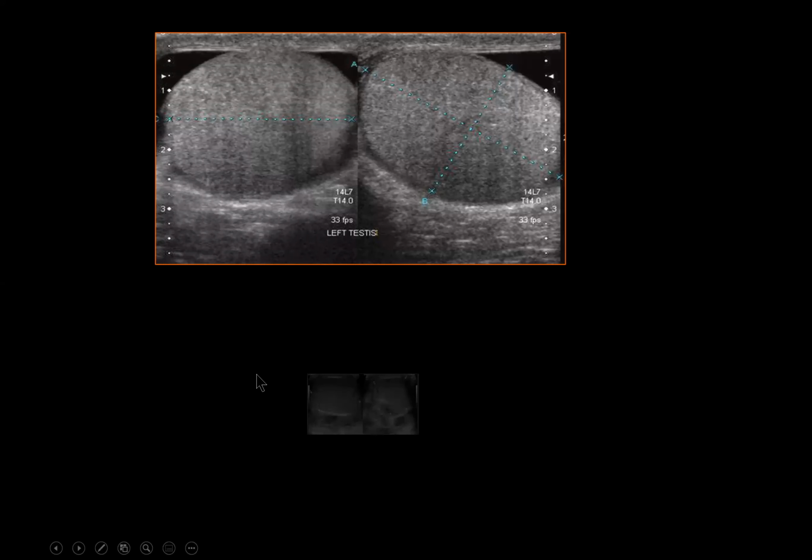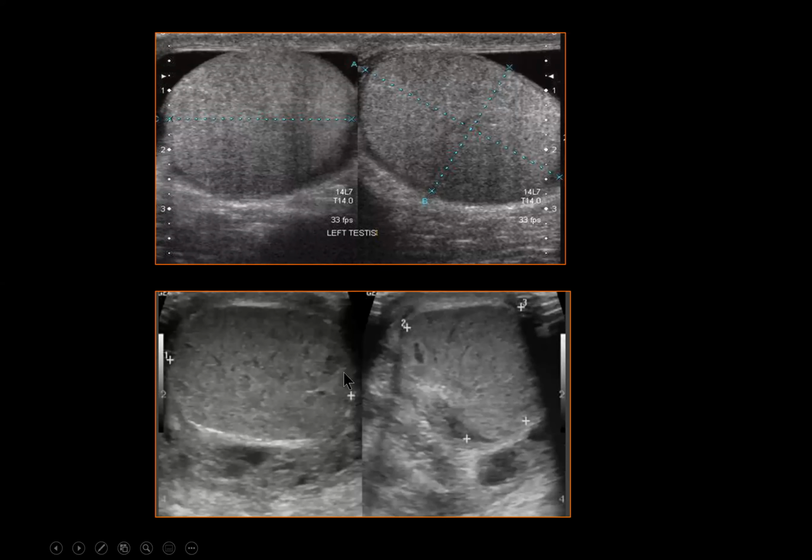And this is another example of testicular torsion, but this is after 12 hours, already damaged. It is heterogeneous in echotexture, and edematous. You will see thick serosa, and the content is heterogeneous, areas of hyper- and areas of hypoechogenicity, and the surrounding fluid, which is edematous fluid.